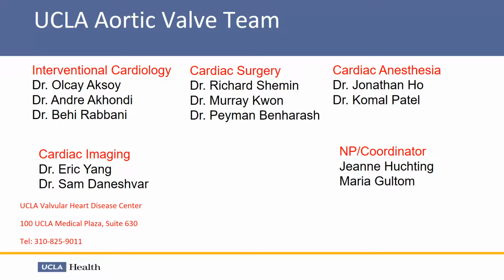So that patient comes in 5 years' time having a STEMI or non-STEMI. How are we going to get into the coronaries? That's an even bigger problem. These are issues we're struggling with. The other thing is that if you have to get an open heart surgery and remove this valve and put a new valve in, the removal of these TAVR valves is very challenging. If you look at redo surgery after TAVR, the patients really do poorly because removing a valve that's already buried into the aorta is a challenge. So in general, what is the benefit of the Medtronic valve is a few things.